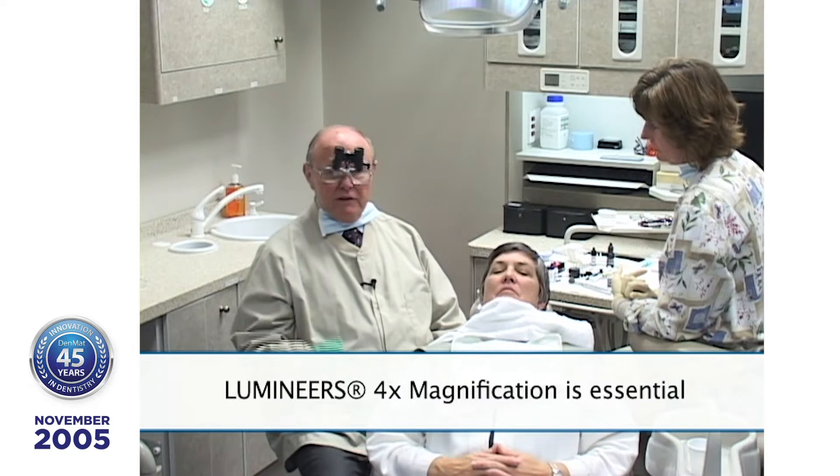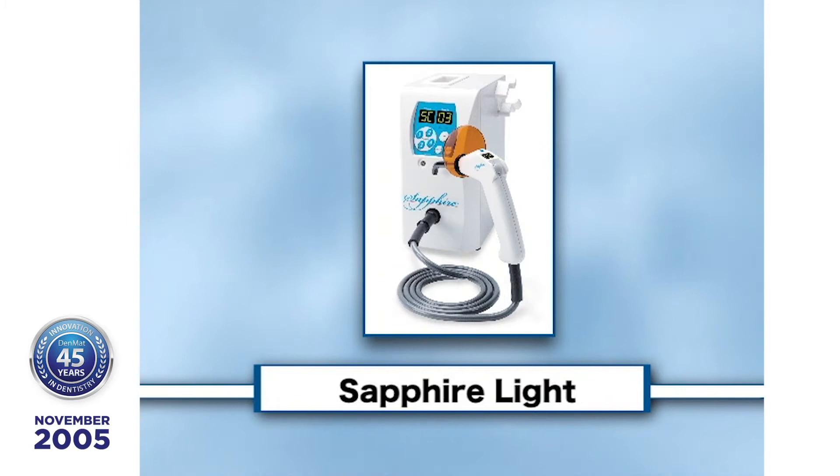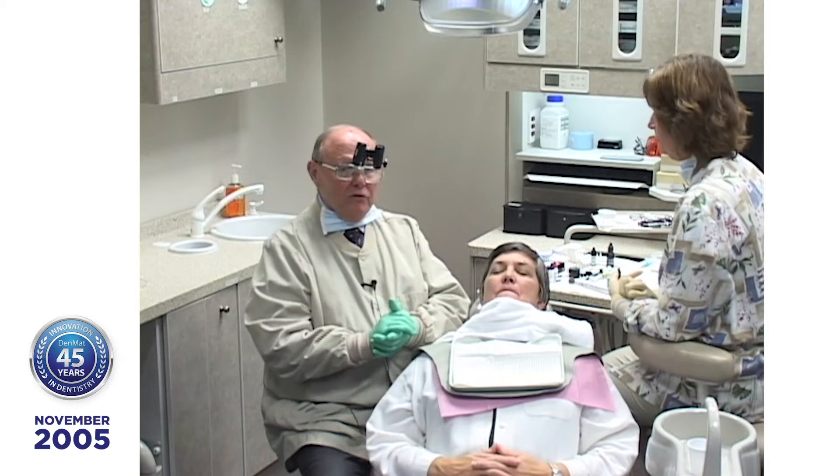The next thing that will make this easy is the pack light. It'll take me less than one minute to place eight lumineers. Today we're placing six and we'll expose each lumineer for about five seconds — six times five is 30 seconds, and it takes two or three seconds to go from tooth to tooth. When you're placing these, you don't want things floating around. You want to get in and get out. When I'm on the runway using my pack light, everything is ready to go.